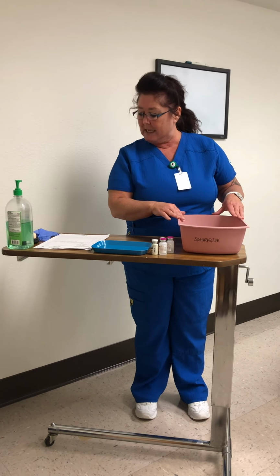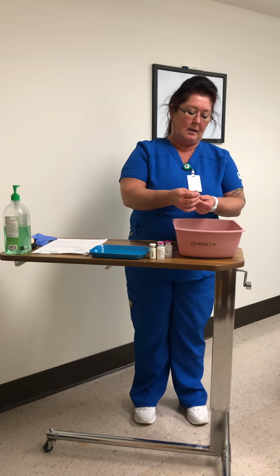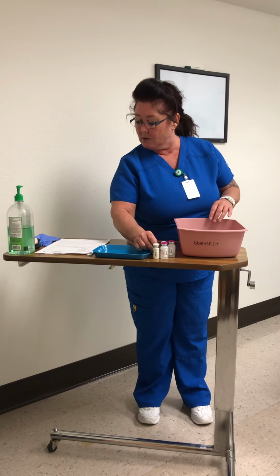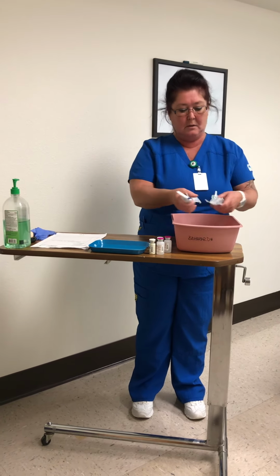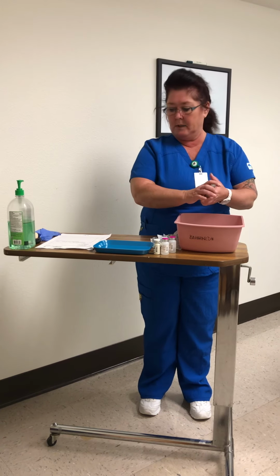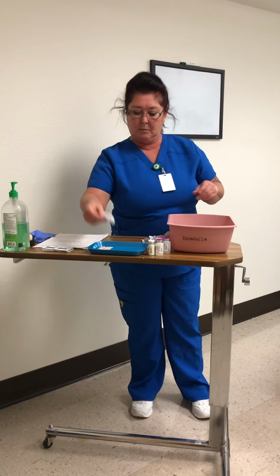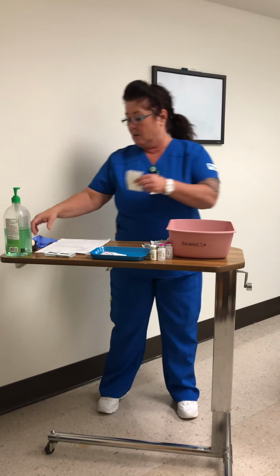Next I have my promethazine, which is an antiemetic, and it is 25 milligrams. That as well is going to have to be dimensional analysis, as this is 1 mil and it's only calling for 25 milligrams. So I am going to get out my needles and all the other supplies that I'm going to need. I'm going to get some alcohol wipes, and I'm going to need Band-Aids, and I am going to need some gauze and labels for my needles so that I know which is which after I draw them.